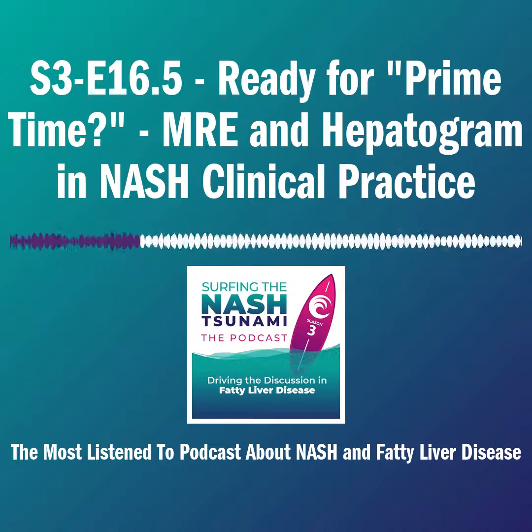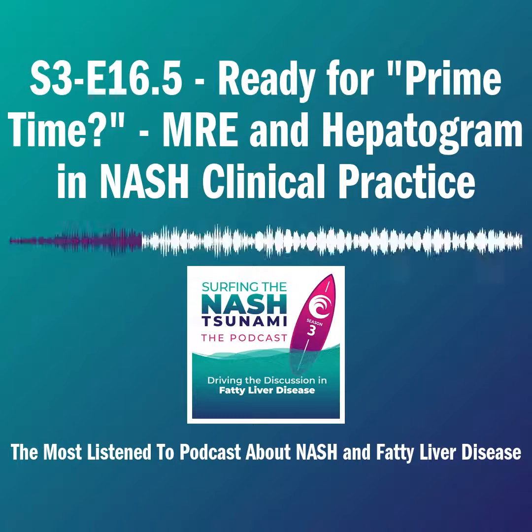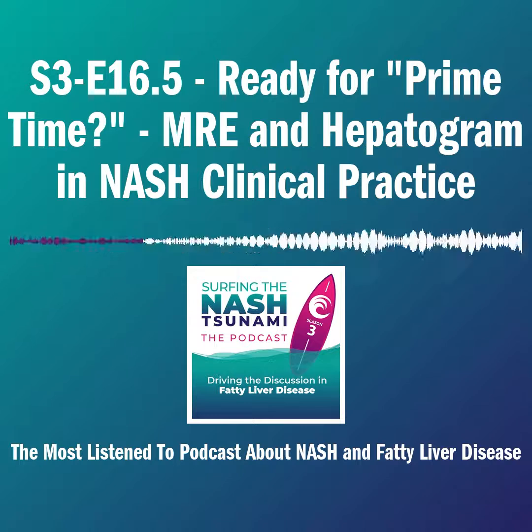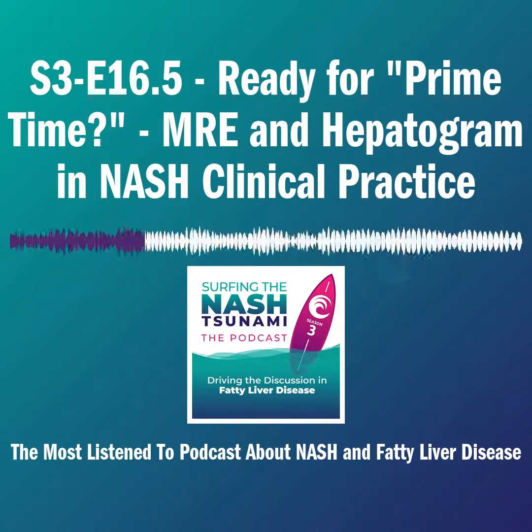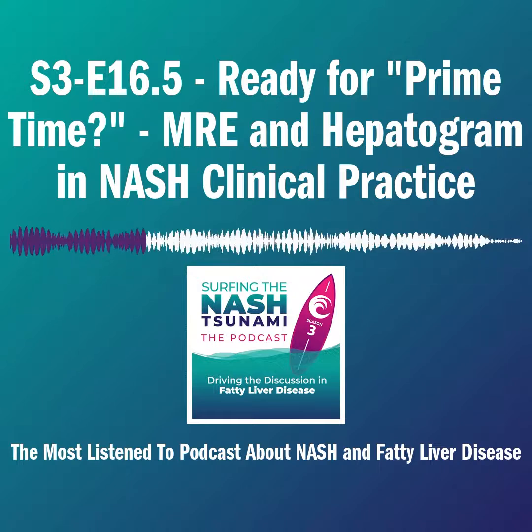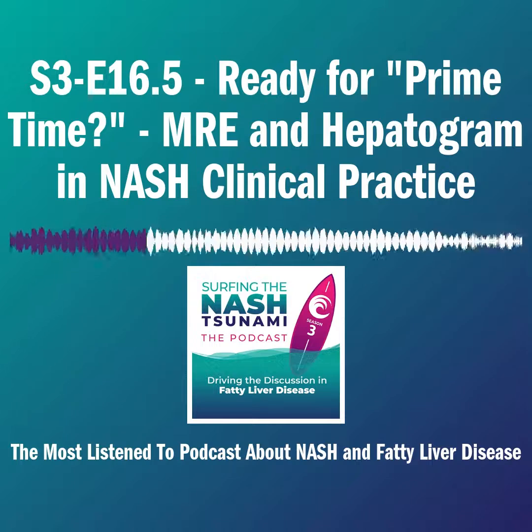Yeah, I think the work Mazen has done on this has been really groundbreaking, and the utilization of the combined PDFF, MRE, and AST to identify the at-risk NASH patient. Just to take it a step further, the work he's done with resmetirom has really validated that using this score, we can do a very good job of identifying the F2 at-risk NASH patient, so the F2 or greater NASH patient, and good at ruling out those that don't have the disease relative to the FAST score, for instance. So more work to do in that regard, but it certainly speaks to the power of the technology and its utilization in the field right now.